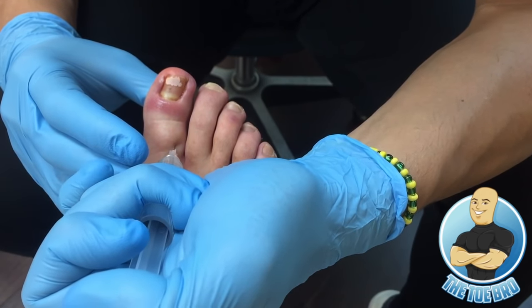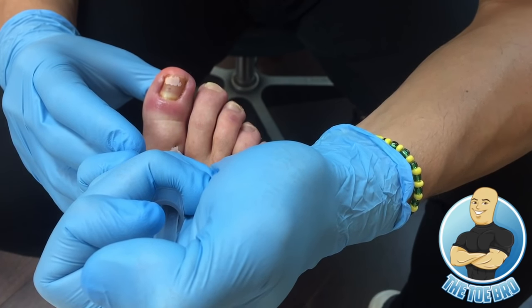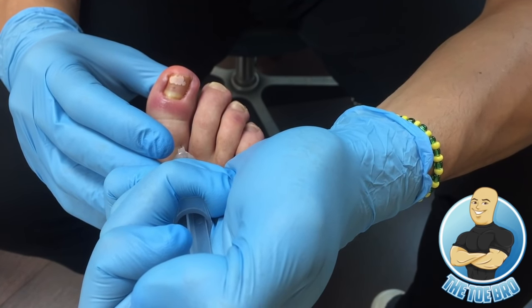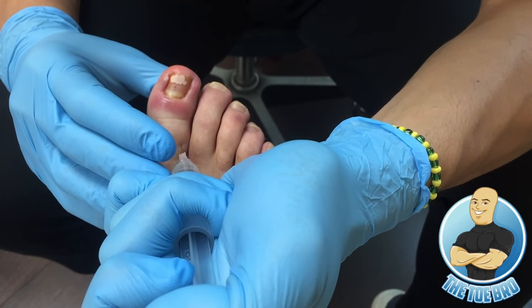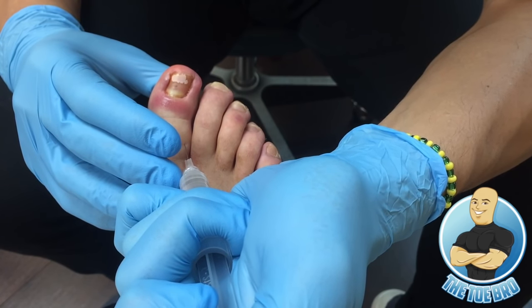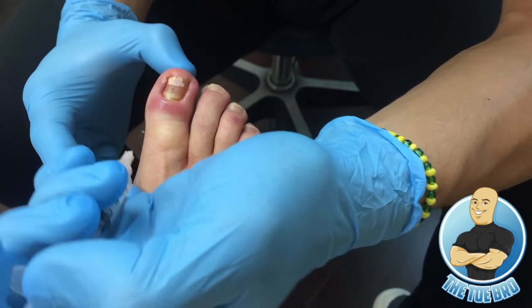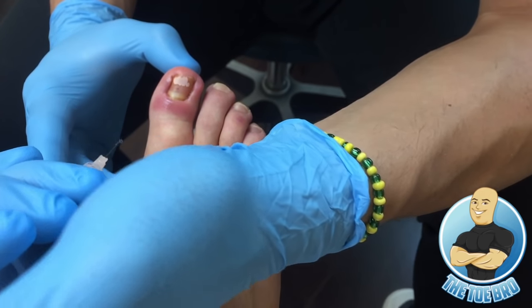Yeah, it is. That's what we want. No pain right now? No, I'm so scared. So, because it's a little bit infected, I'm gonna have to add a little bit more than normal because sometimes it takes a little bit more freezing to get a toe like this numb. You got a small little toe though. Any pain? No. So we gotta do one more side and the whole toe will be numb, okay? Doesn't hurt the other side? That one hurt a lot? No, there you go.